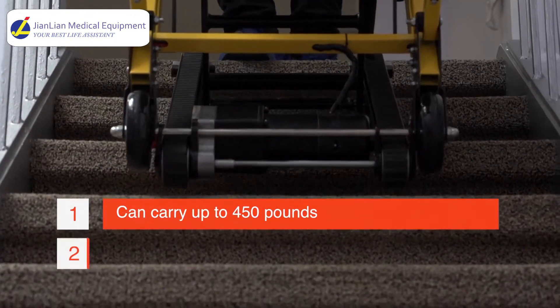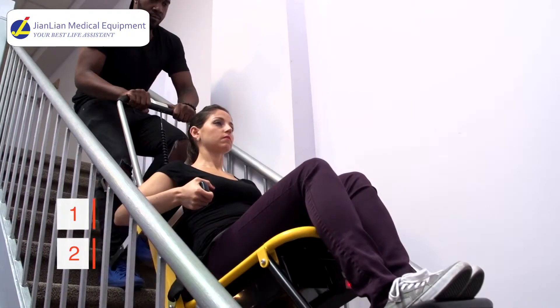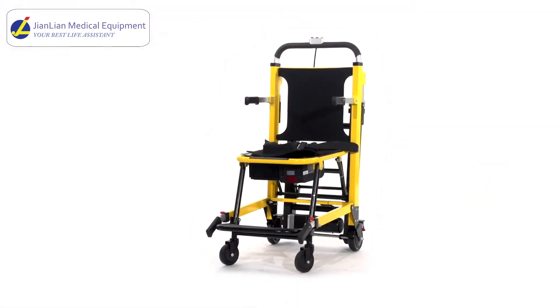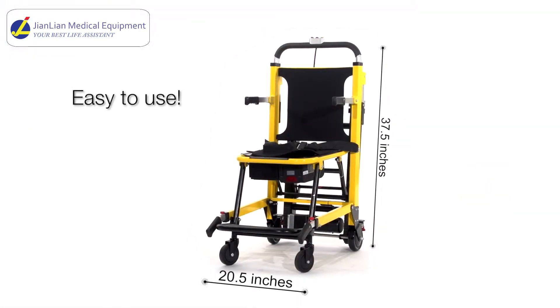Welcome to the new era of Ambulant Mobility, where you can take up to 450 pounds up to 100 flights of stairs with the push of a button. No need to install tracks on your stairs and no need for personnel to take you up and down anymore. The motorized stair chair can easily be handled by a household member with very easy training.